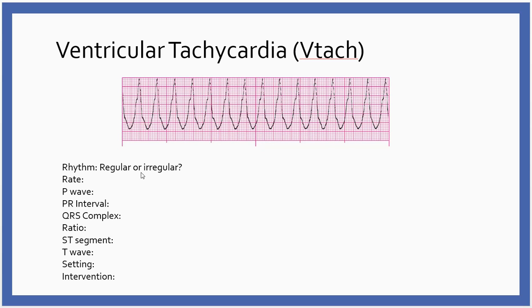So as soon as we can get that monitor defibrillator rolled into the room and get them attached, we're going to go ahead and charge, and we're going to defibrillate. And then immediately after we defibrillate, we're going to resume CPR. And so we went through the BLS, ACLS algorithm, and hopefully we can get them back into some sort of a sustainable rhythm. So that's our plan with VTAC.